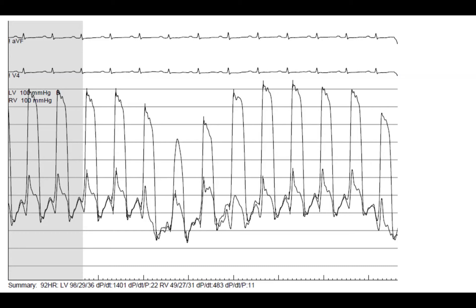Discordance means they move in opposite directions, and it suggests constrictive pericarditis. It's highly specific for constrictive pericarditis, and that's what we would be looking for.